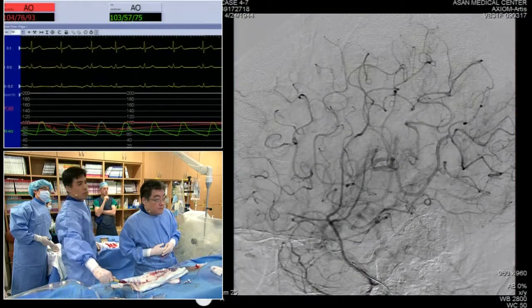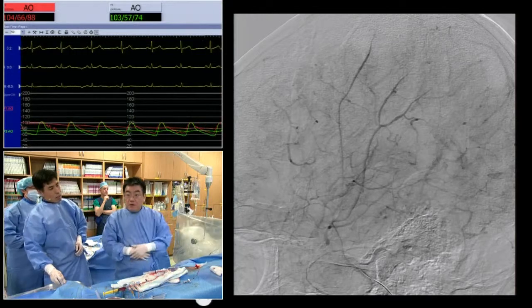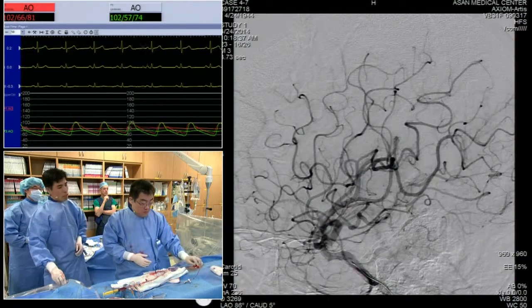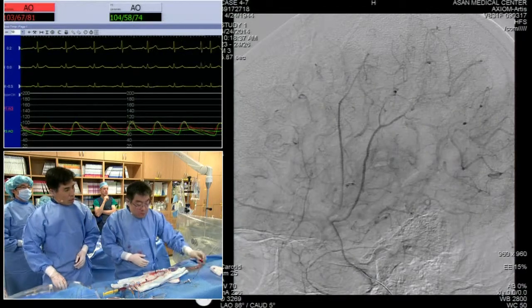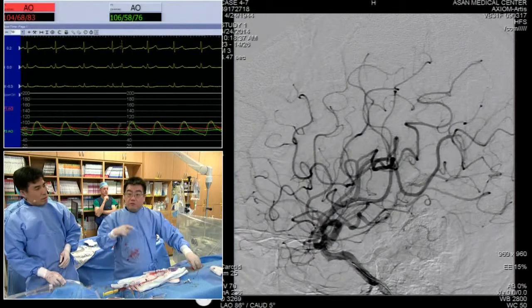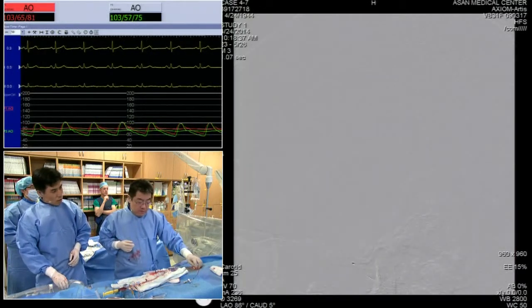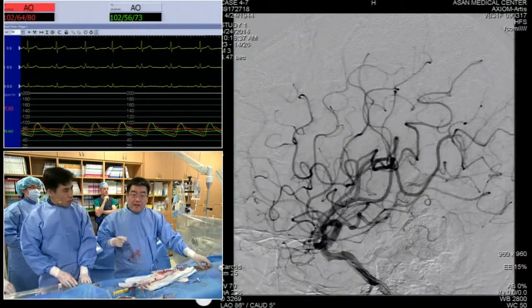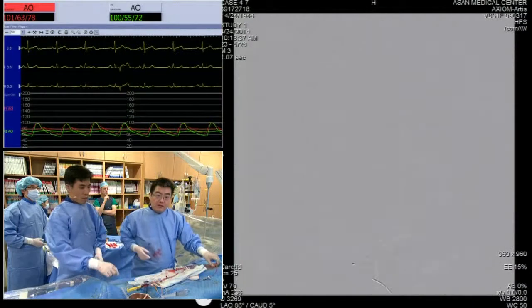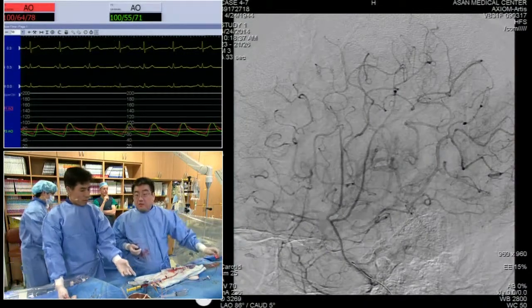Okay, no problem. Looks very good. My question was: have you seen emboli on the angiogram in a patient who did not have symptoms at that time? Yes, like I had explained, right after the procedure we will do the angio. There are several cases of mine where we detected an emboli, but at the moment of the angio the patient is still fine, and then 2-3 minutes later the patient starts to become a little bit symptomatic.